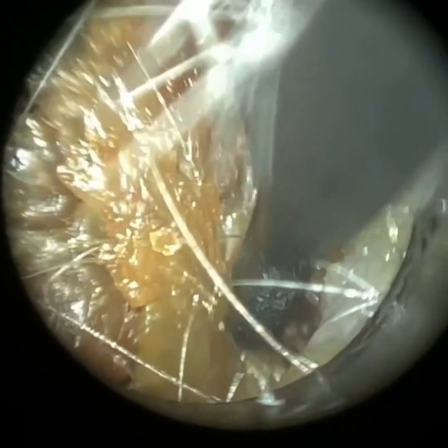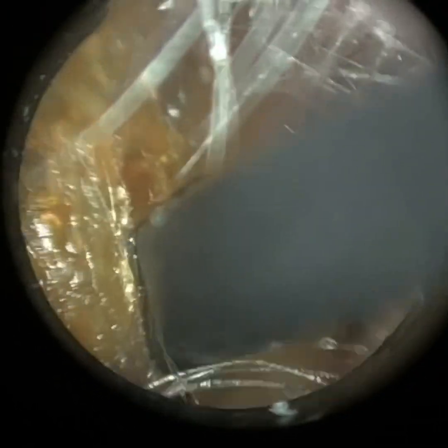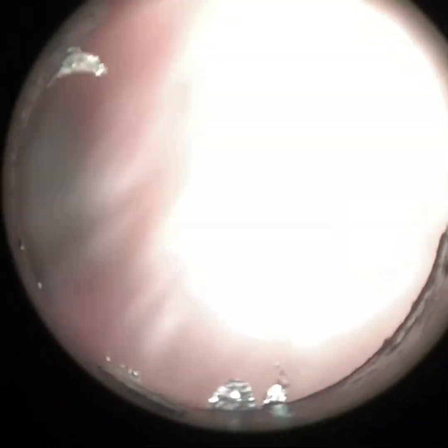Now I'm using the right-angled corette, and I'm just inserting it posteriorly — so this is the back part of the ear canal — and I'm just getting some leverage. Surrounding this plug of wax is a layer of thick skin; it's enveloped around it. You can just see it there. So I managed to remove some of that with the corette.